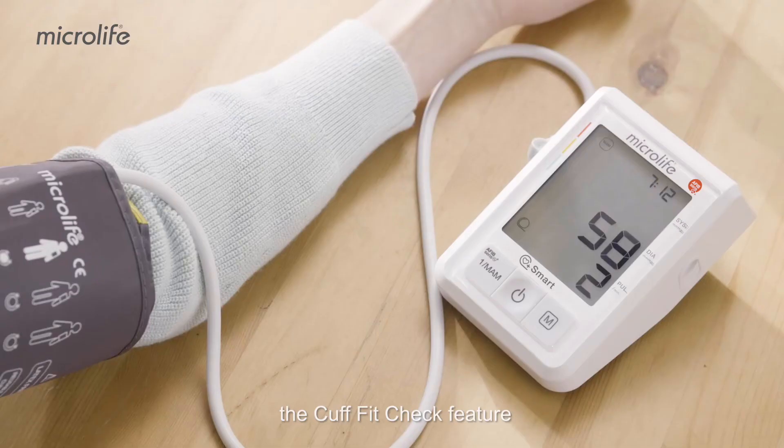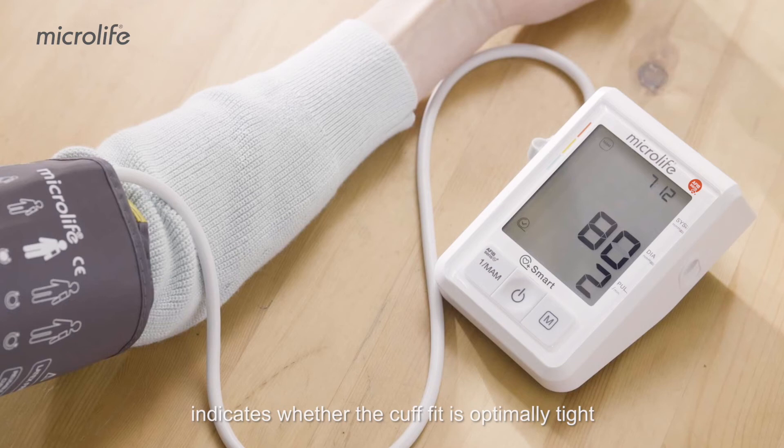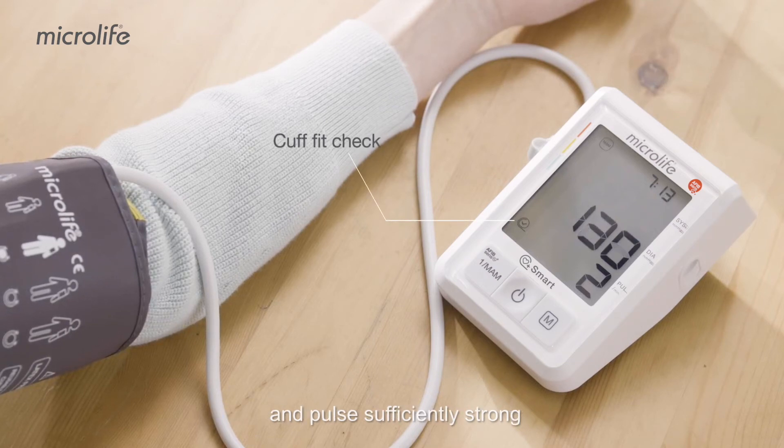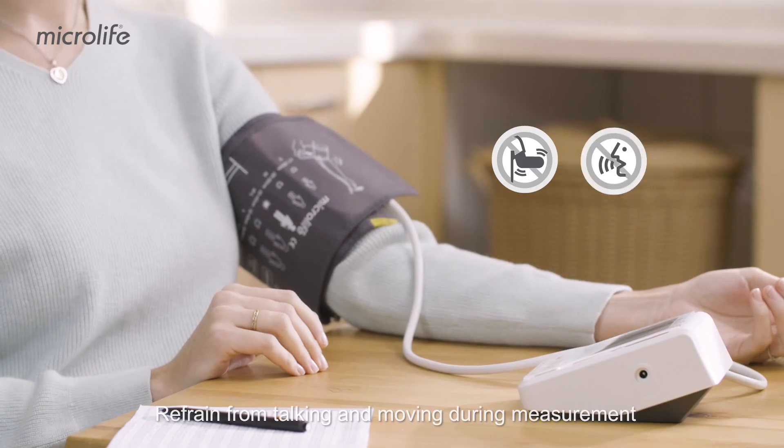During inflation, the cuff fit check feature indicates whether the cuff fit is optimally tight and pulls sufficiently strong. Refrain from talking and moving during measurement.